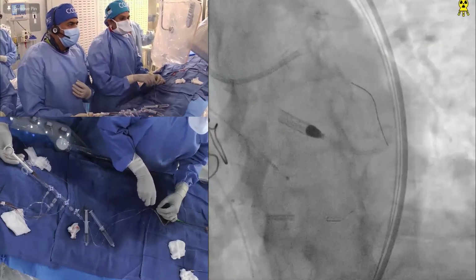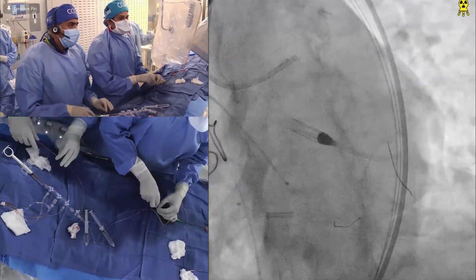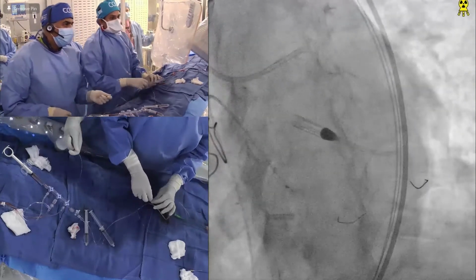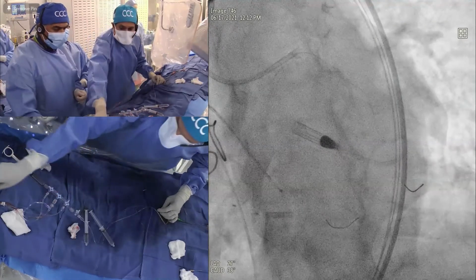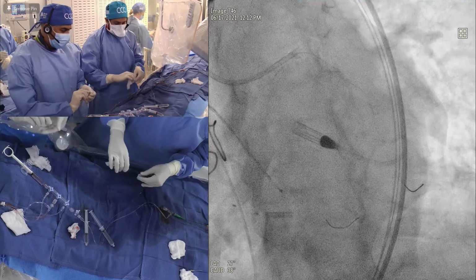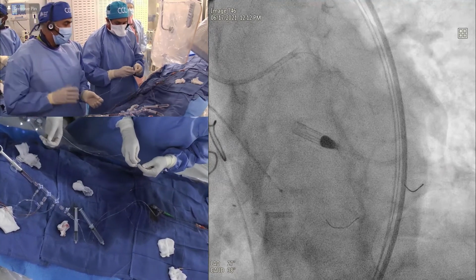But I think it may be just a little bit a technique point of view also. Because I can tell you the data at our own Sinai, we do have some burr stock, but if you take 1.25 or 1.5 or 1.75, 80% was 1.5. About 15, 16 or 18% will be 1.75. 1 or 2% will be 1.25.